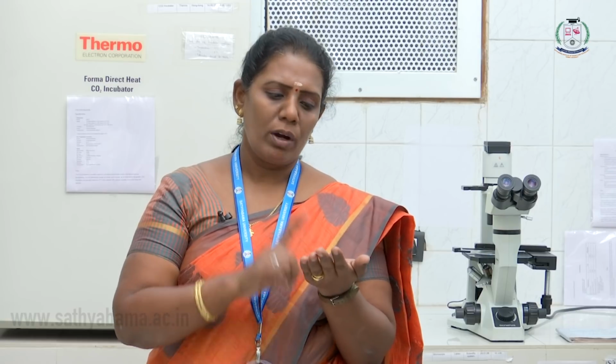So slowly we have to flush the cells, and transfer these cells into 20 ml of the respective media which are utilized, and segregate them into 4 different flasks. So that is the conversion of 1 flask into 4 flasks, and otherwise we can maintain this particular cell line. Our subculturing and maintenance can be performed the correct way. So this is the subculture and maintenance of the particular cell lines.